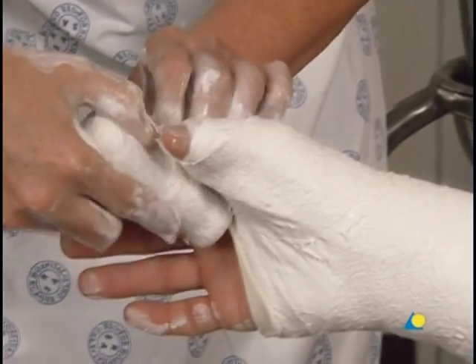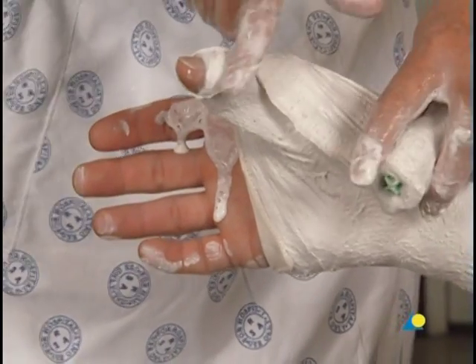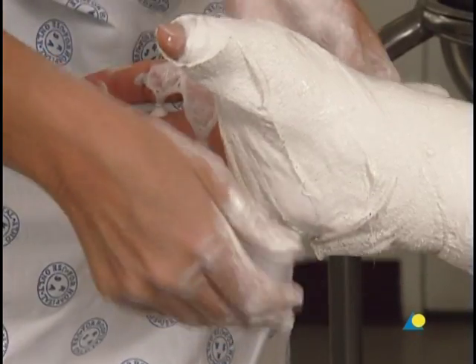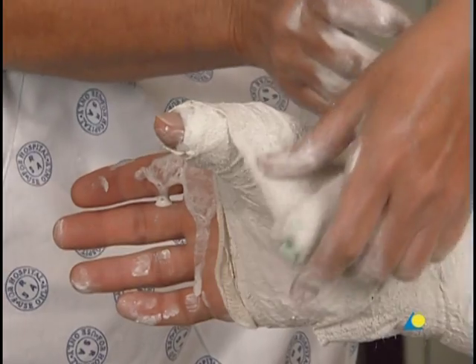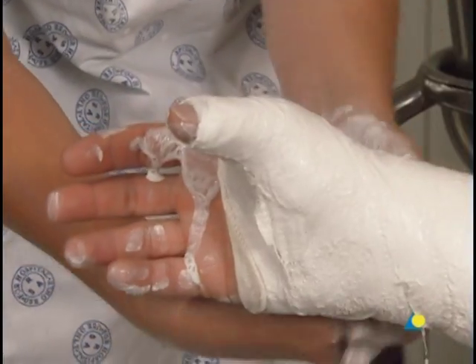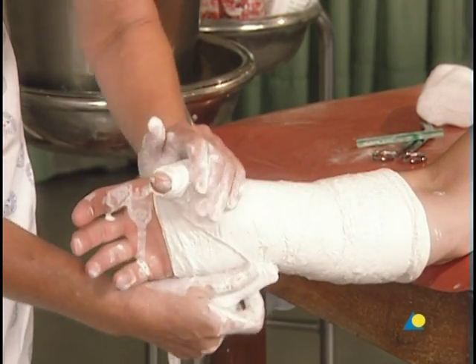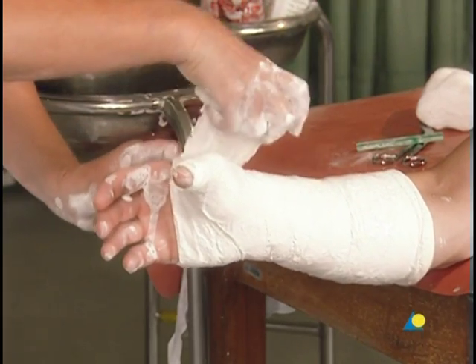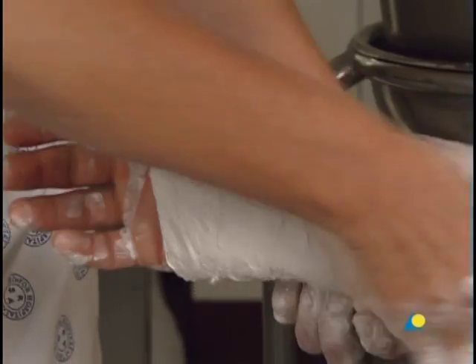The full width of the bandage rolled around the thumb forms a V at the base of the thumb. This step is repeated. Although there is no bundle of plaster at the base of the thumb, it has been sufficiently immobilized. The plaster bandage is then passed through the first web space, around the wrist, and towards the elbow.